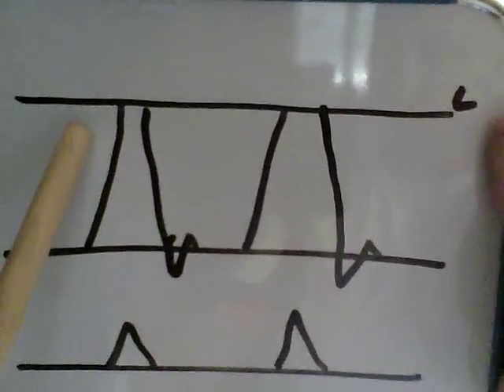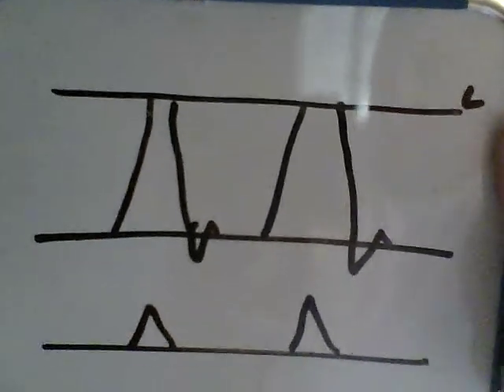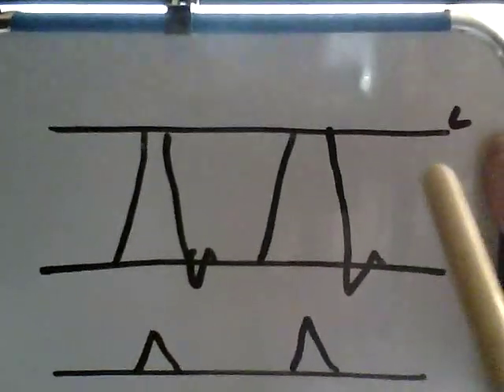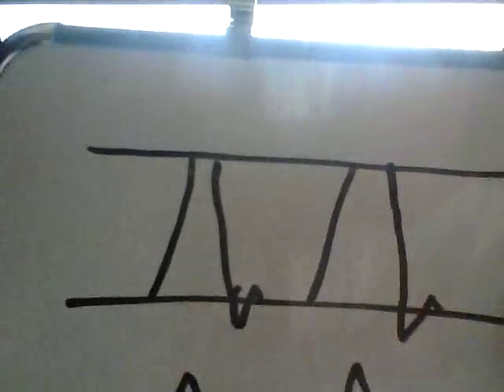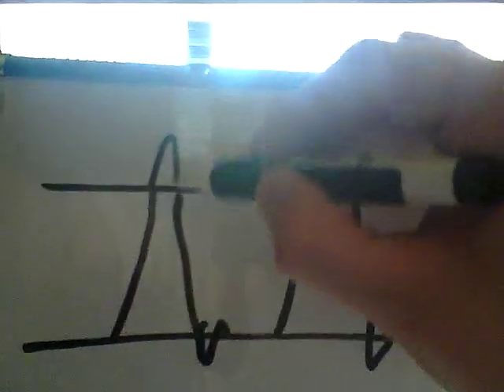Let me get this a little better. And I'm rolling up to the bottom here. That's aliasing. That's inaccurate. Because if I have my speed limit set to this, am I really telling the doctor exactly how fast it's going if I know that the waveform should look like this?